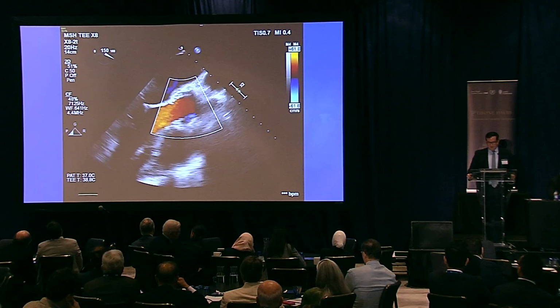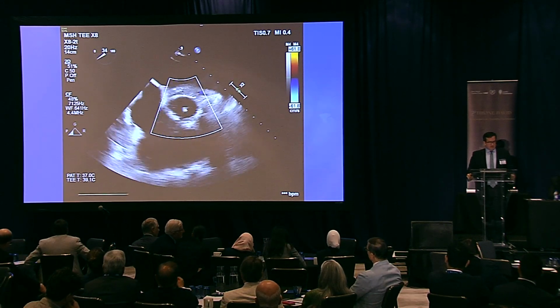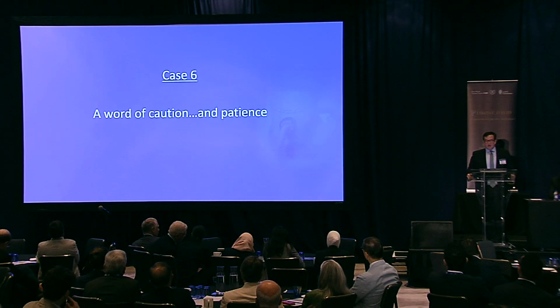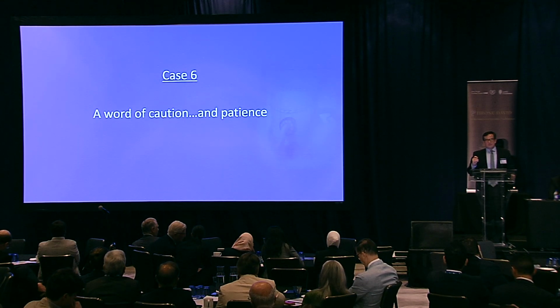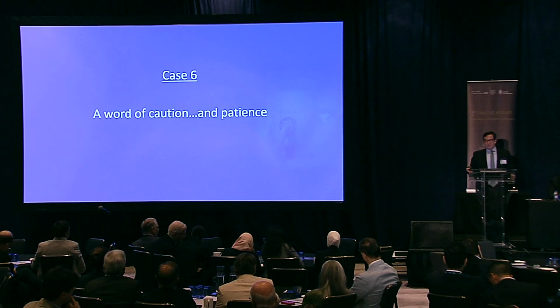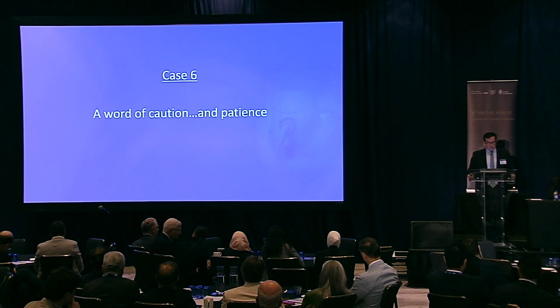So again, now after repair of both jets, we have that trace central jet, and we're much happier with that result. And the patient did well afterwards. So the one thing with these, as I said, is that you have to analyze them, and that's how you're going to make your repair decisions, what leaflet you're going to do a plication of. But also give it time.